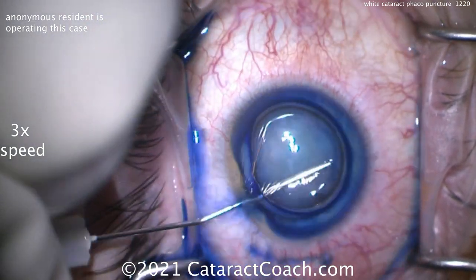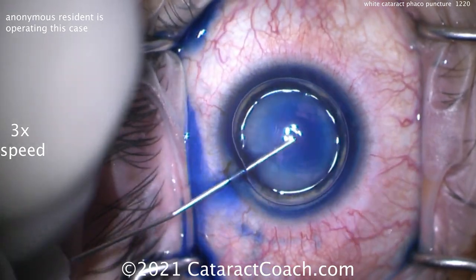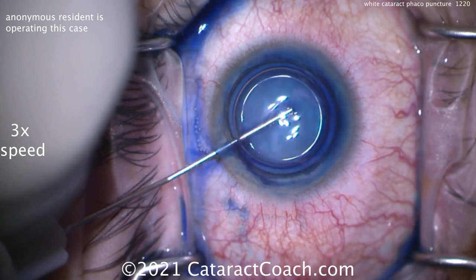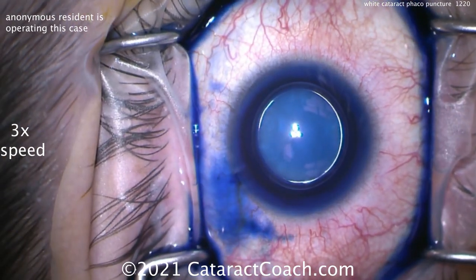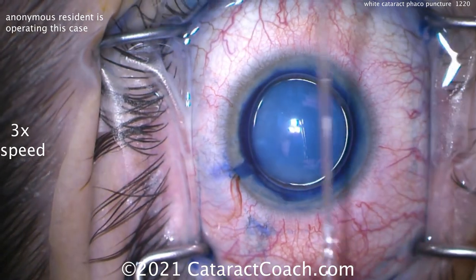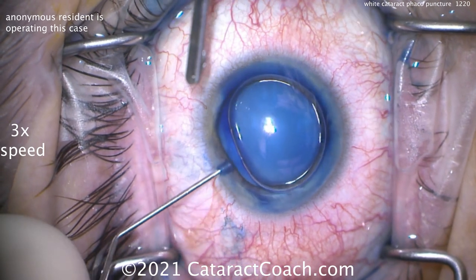Now trypan blue dye staining going inside the eye, putting that around. You don't have to use an air bubble — you can just use it regularly. Injecting the trypan blue dye is obviously important. And we're tapping the center of the lens to see how pressurized the capsular bag is. In a lot of these cases you can get a very pressurized capsular bag, and I think this one is pressurized.